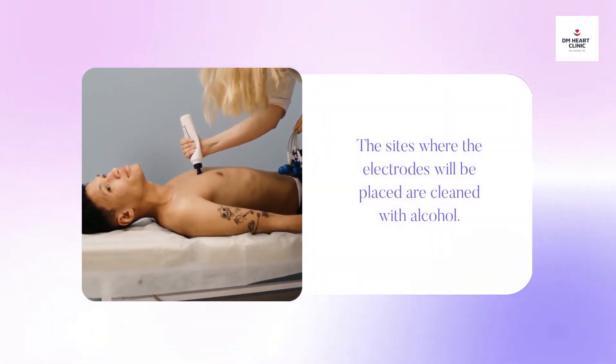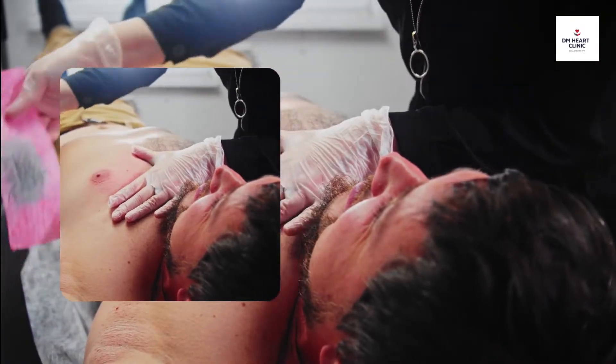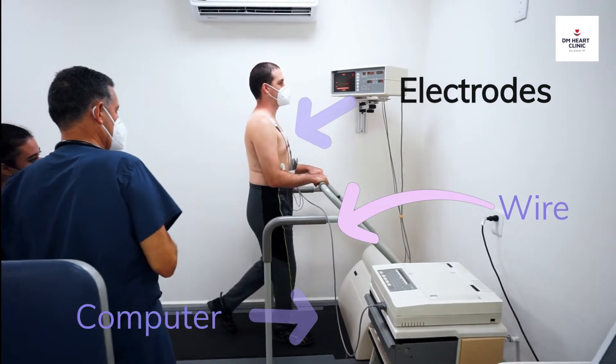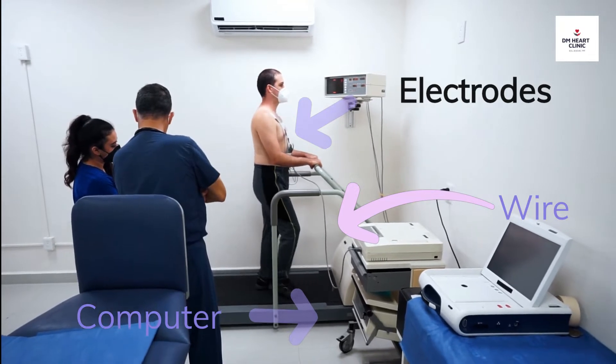The sites where the electrodes will be placed are cleaned with alcohol, and you may need to shave your body hair to help the electrodes stick. Wires connect the electrodes to a computer, which records the heart's electrical activity. A cuff on your arm allows monitoring of your blood pressure during the test.